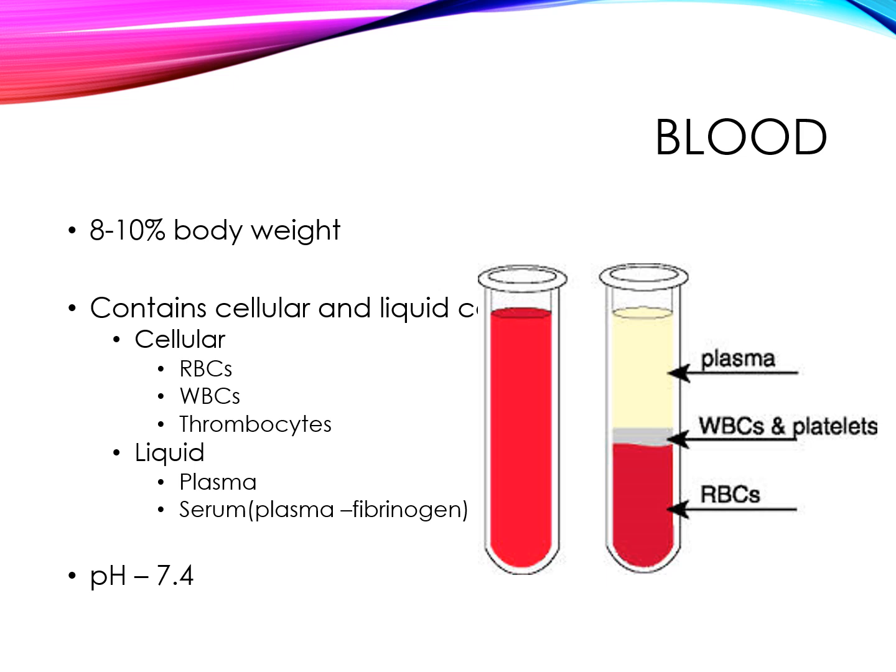Serum comes from plasma that has clotted. So once blood has clotted in a tube, for example, fibrinogen, which is a clotting factor, is removed during the clotting process, and the fluid that is left over is called serum. So plasma is the natural component of whole blood, and serum is derived from blood once it has clotted. Blood usually has a pH of 7.4 or just above 7 for humans and small animals.